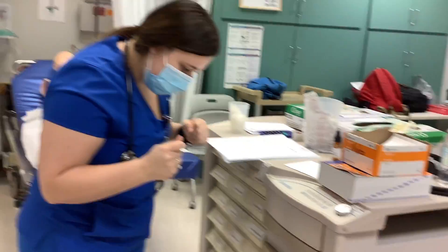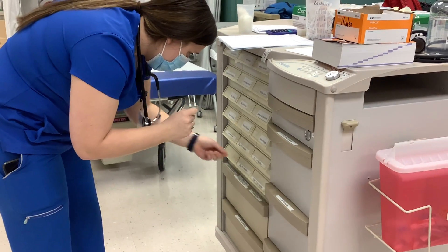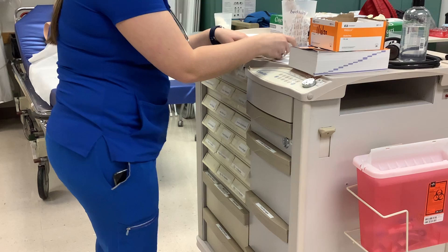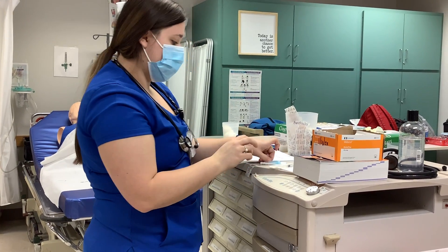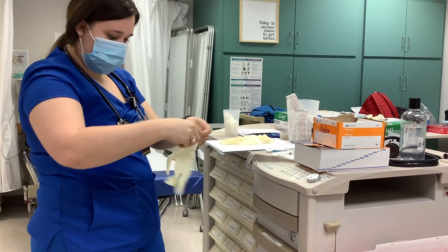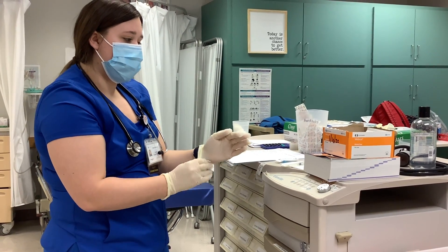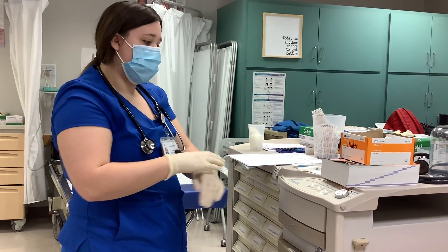We have Fluzone here — we're going to start with that first. This is intramuscular, so we're going to grab a 23-gauge needle. We're doing 0.5 mL, so I'm going to grab a 1 mL syringe. These are unopened, intact, and unexpired. I have also referenced my drug book. I have considered all the nursing indications, the side effects, any adverse reactions, and I have made sure that they are all compatible.